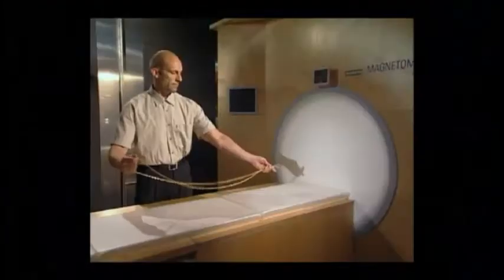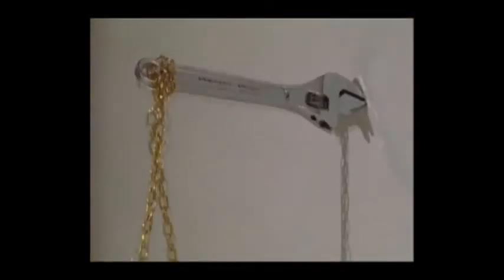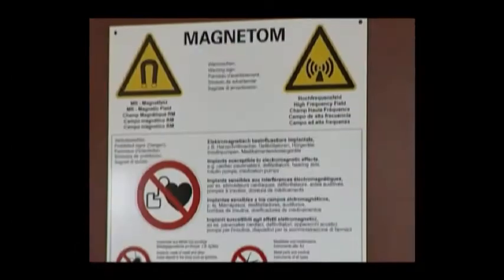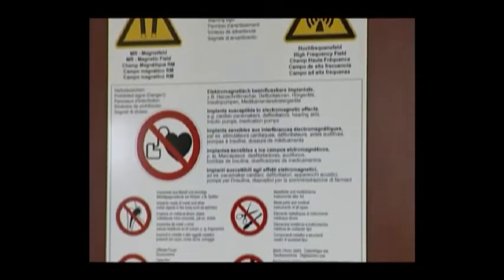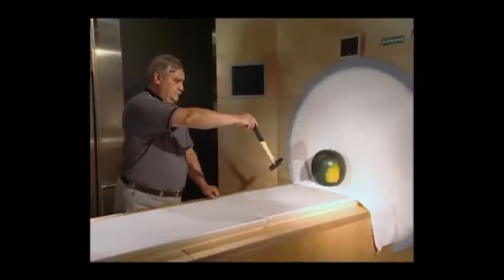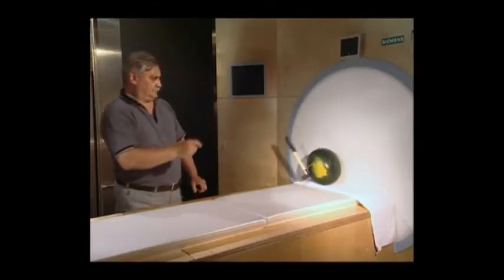Because of the extremely strong magnetic fields used in MRI, there are serious safety precautions that must be followed. Any items containing ferromagnetic metals, such as iron, nickel, and cobalt, must never be brought anywhere near the MRI machine, especially inside the MRI room. Anyone with a pacemaker, implant, defibrillator, cerebral aneurysm clip, or hearing implant containing ferromagnetic metal may never have an MRI exam or enter the MRI room. Any loose items brought near an MRI machine can become dangerous projectiles with extreme speed and power.